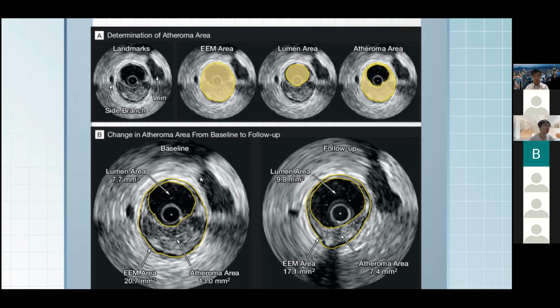But even at this extent of the blockage to the arteries, since the arteries can still allow blood to come through, you won't see anything on the angiogram. But you can clearly see the atheroma, which in this case is the atherosclerotic plaque, indicated by the clump of blood cells and cholesterol, basically. You can see it very clearly with IVUS.